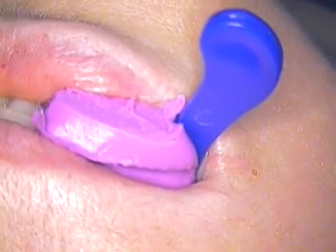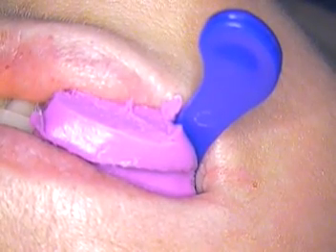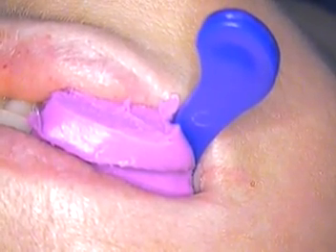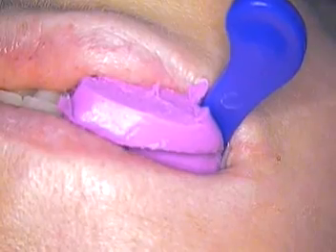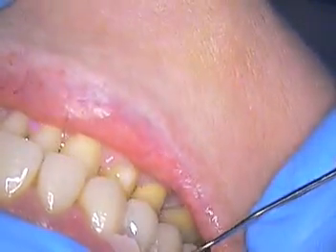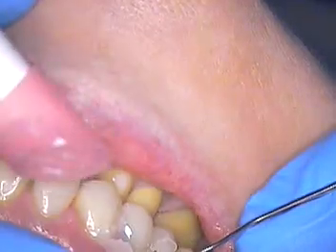The key is to tease it out without distorting the temporary — it's just a soft shell. By 50 seconds it's going to be semi-hard, more soft than hard. Anything more than that and it could lock in around other teeth, so we try to go with 50 seconds and be very gentle removing the temporary. About five seconds to go — go ahead and open, suction the lingual, bite down together, tap tap. Good, stay together while I remove some of the excess without distorting it.